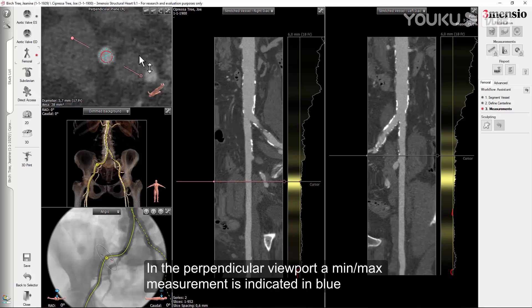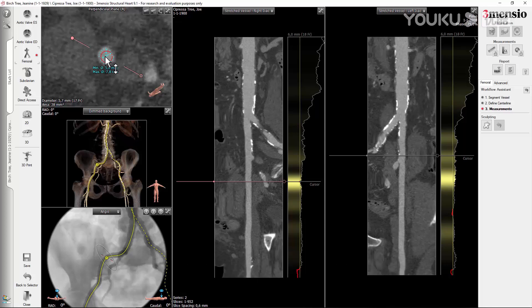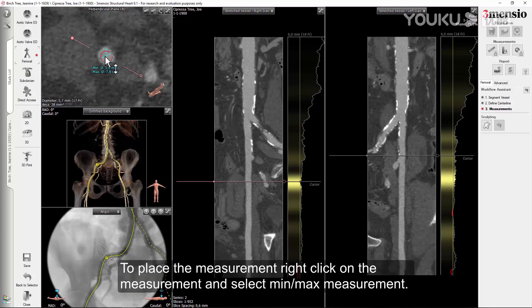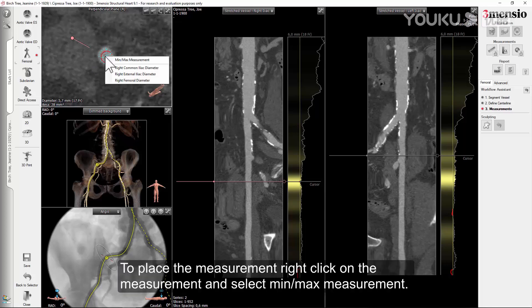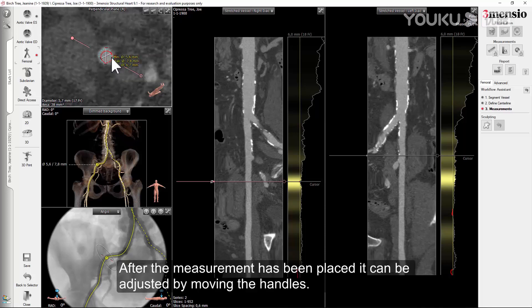In the perpendicular viewport, a min-max measurement is indicated in blue and the values will appear when hovering with the mouse over the segmentation. To place the measurement, right-click on the measurement and select Min-Max Measurement. After the measurement has been placed, it can be adjusted by moving the handles.